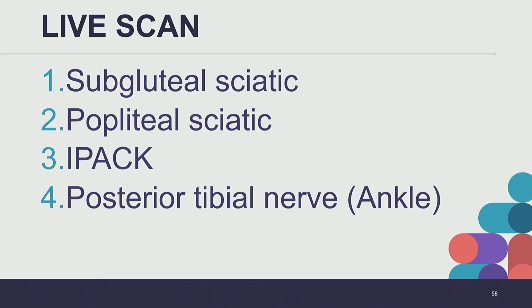And then they're starting to split. So together, and now they're starting to split. And the variability in terms of distance away from the popliteal fossa is quite apparent in every patient. So roughly 7 to 9 centimeters cranially to the popliteal fossa is where you'll see the convergence of that posterior tibial and the common fibular.